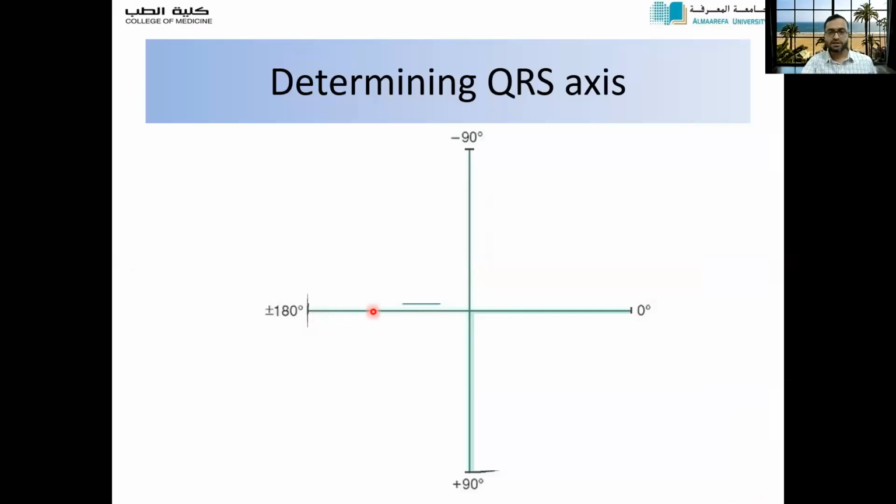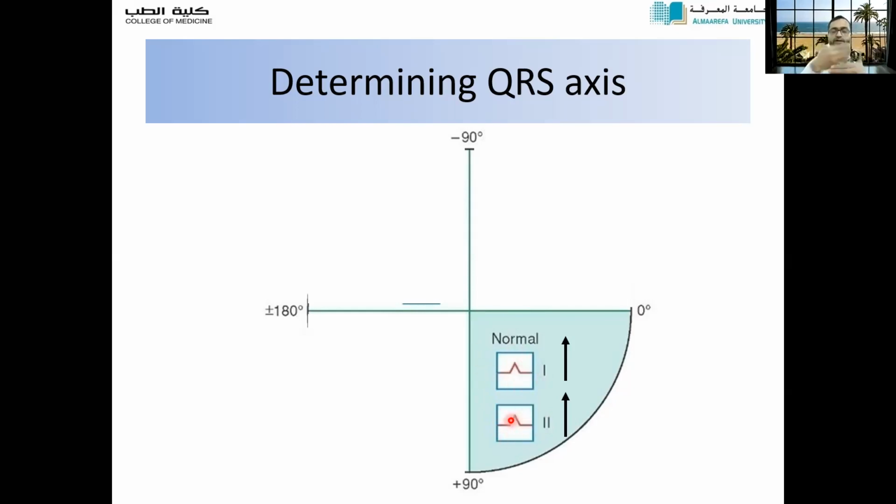So let's see some crude method. Lead 1, lead AVF. Again, these two leads you should not forget. Always look at them. For example, for the lead 1, by mistake it is written as 2 here, but please correct it, I apologize for writing this wrong. It's AVF, the second lead is AVF here. Always put lead 1 above and lead AVF below. In your imagination, whenever you see the ECG, put lead 1 above and lead AVF below.